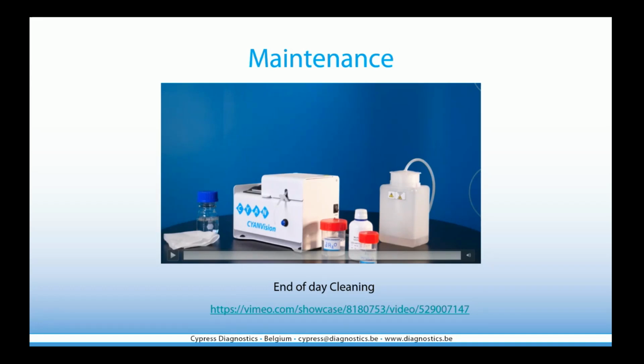So this is how you do the end of the day cleaning. It only takes you 5 minutes, but if you do it every day, then you keep your instrument at a high performance. It is important to know that you can easily wipe off the CYANVision, but not with hypochlorite or a corrosive solution. Just do it with the washing solution that is delivered with the CYANVision.